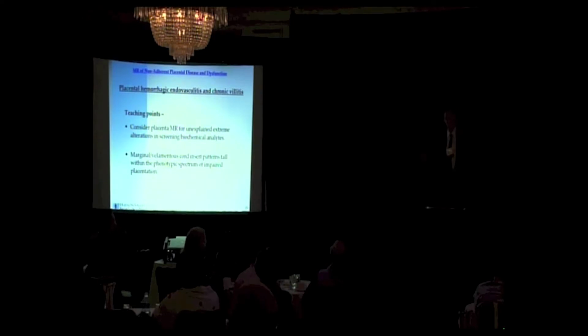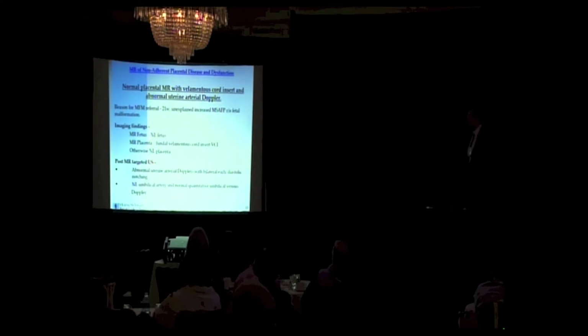It should be sought in all ultrasound studies, and if found, it's worthy to pull out your first trimester biochemical analytes, your quad screen analytes, look for extreme abnormalities, do uterine artery Doppler at minimum. And I think this will be the last case.